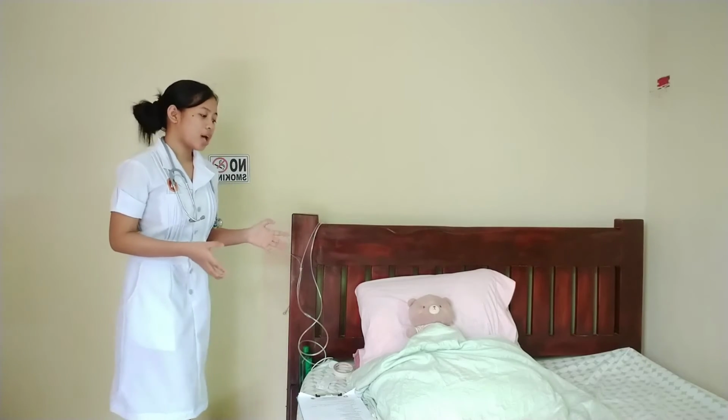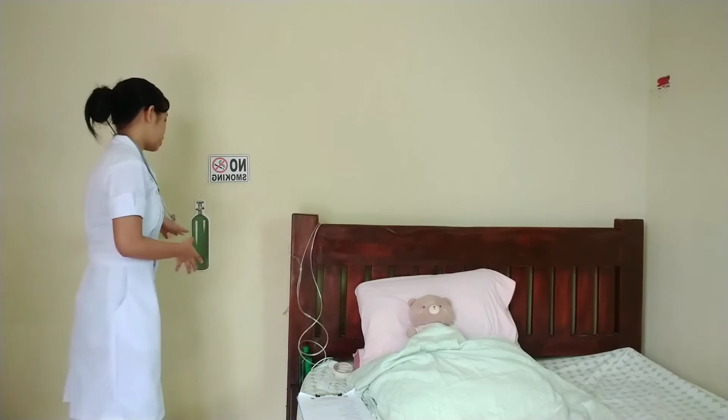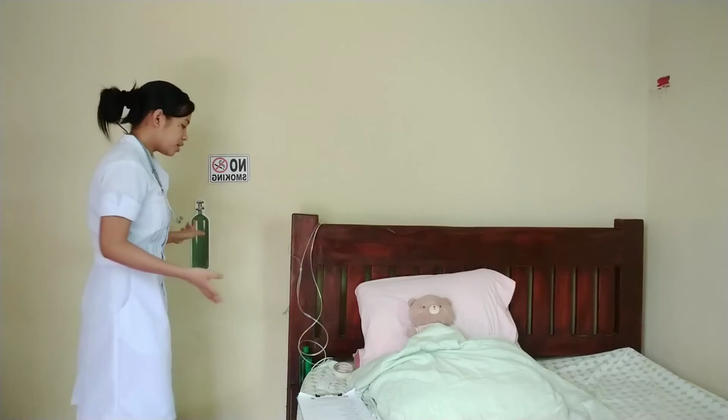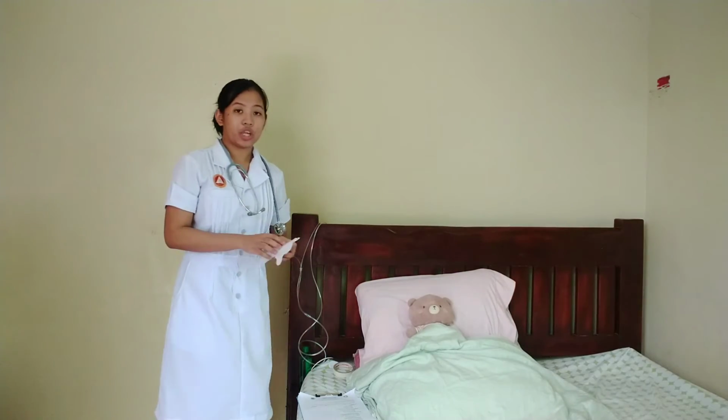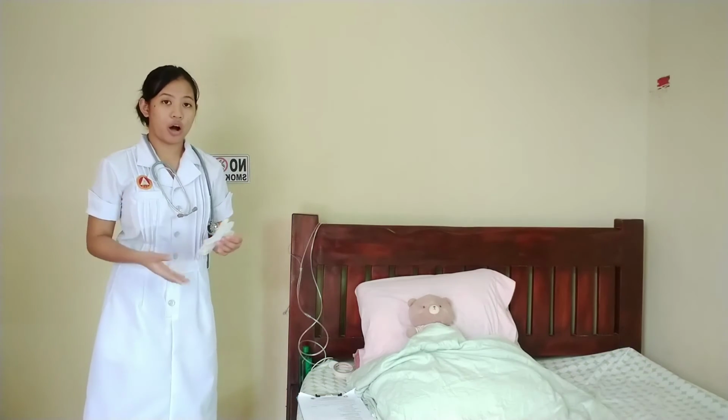And then after that, I will now assemble all the equipment that I will be using for this procedure. So we have here the oxygen tank. So I will attach the flow meter to the tank or to the wall outlet, and the position of the flow meter should be off.